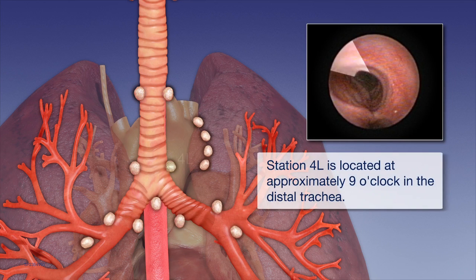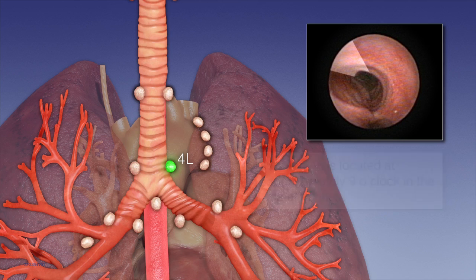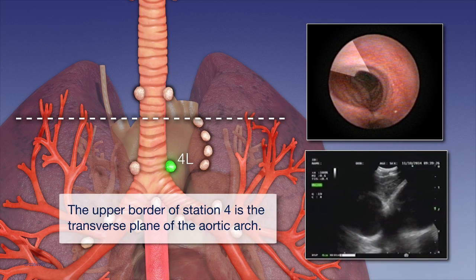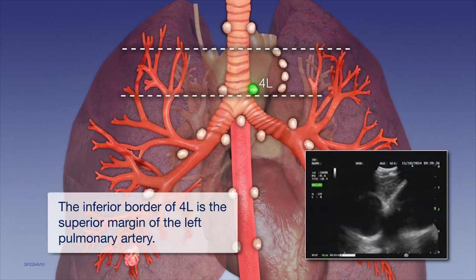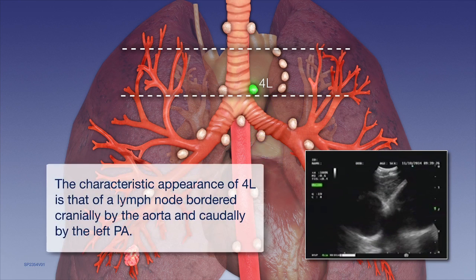Station 4L is located at approximately 9 o'clock in the distal trachea. The upper border of Station 4 is the transverse plane of the aortic arch. The inferior border of 4L is the superior margin of the left pulmonary artery. The characteristic appearance of 4L is that of a lymph node bordered cranially by the aorta and caudally by the left PA.